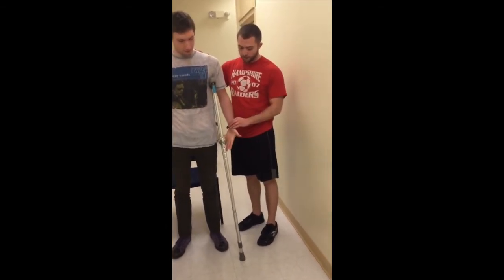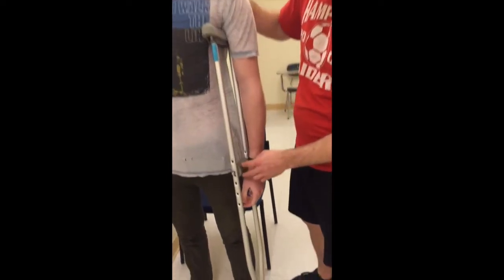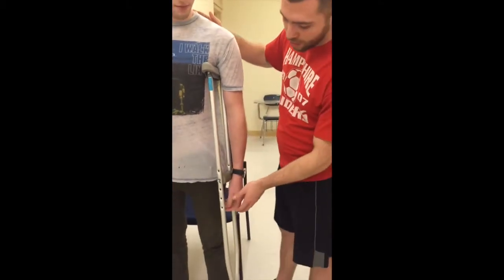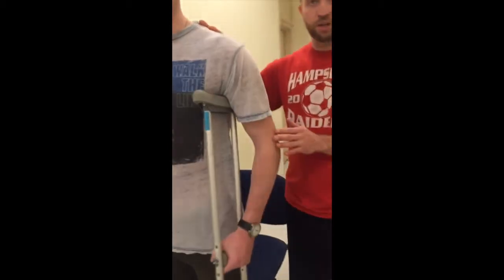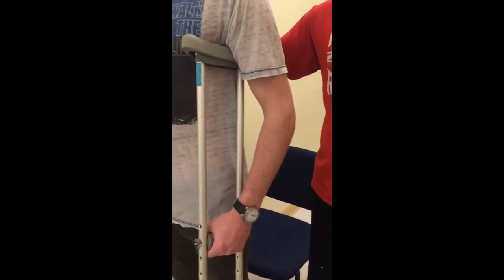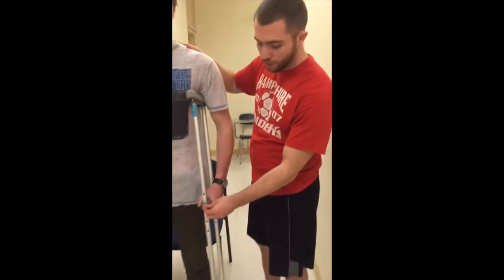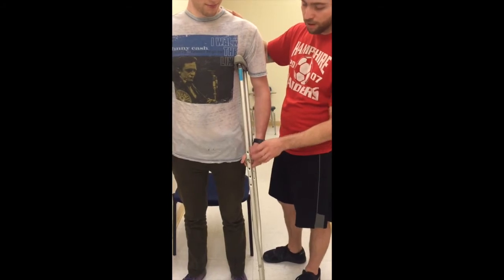Okay? So one way that we're going to do this is we're going to have our patient relax his arm. And we want to make sure that the hand grip matches up with the styloid process when his arm is relaxed. Okay? Another way that we want to check this is we're going to have Will grab onto that hand grip, and we want to see that his elbow is at a 20 to 30 degree bend. So those are 2 ways that you're going to check that. If you have to change it, you're going to unscrew this bolt right here and change the hand grip. Okay? We don't have to.